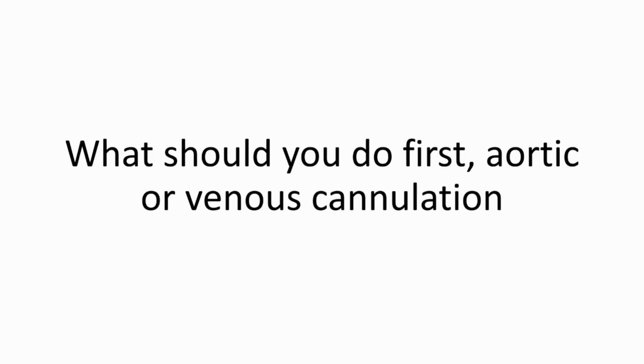For almost all surgeons, the threshold at which the activated clotting time is high enough to institute bypass safely is 400. Okay, this is a good thing to be aware of. Activated clotting time greater than 400 means that the blood is thin enough to put the patient on bypass. Remember, we are thinning the blood in order to safely prevent the blood clotting in the bypass machine before it's being returned to the heart.